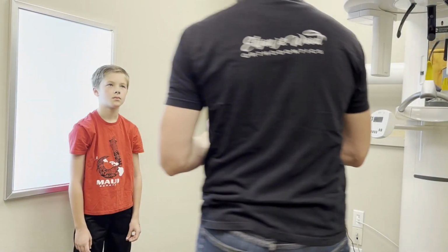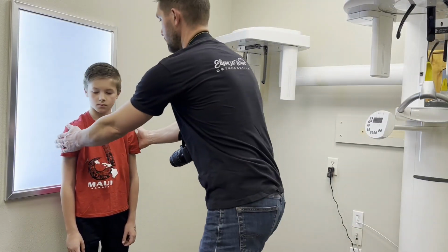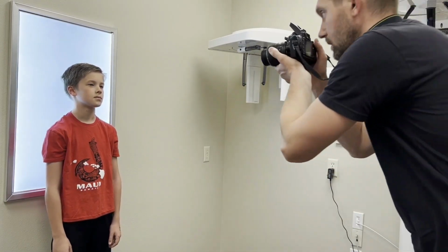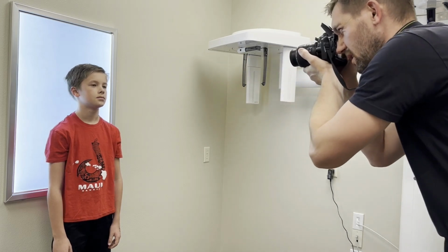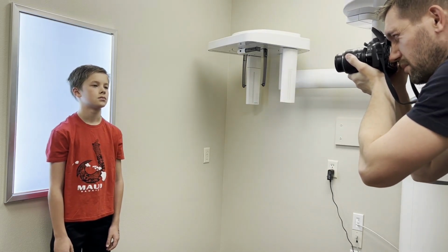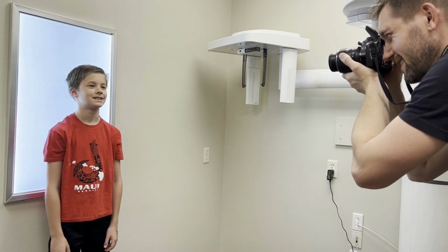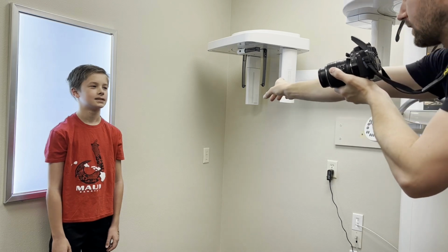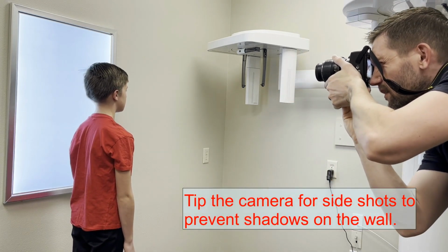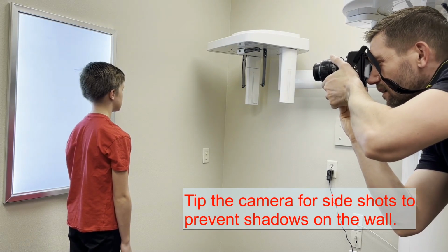Okay, so we're going to take your photos. Go ahead and stand right here in front of this thing, centered up there, yep. And then this first one's no smile at all, just look straight at me. Okay, now big smile, funniest joke you ever heard. Now turn that way and look straight at the wall. Perfect. Okay, so now we're going to take photos of the inside of your mouth.